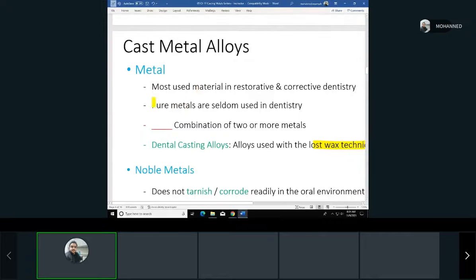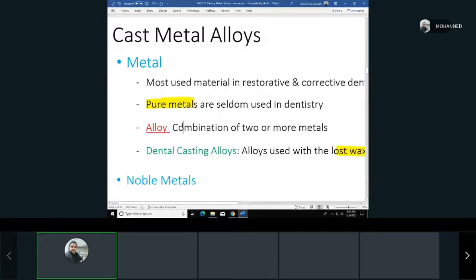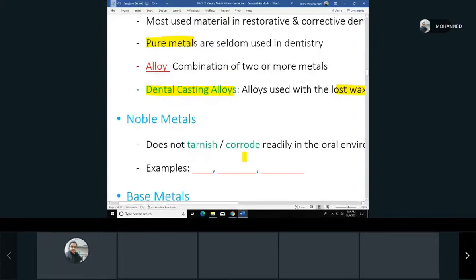We don't use metals right away as pure. We always use them as an alloy, right? Which is a combination of two or more, because this would provide us with better qualities of the metals that will make them withstand the oral environment. So the metals that we use with the lost wax technique, we call them dental casting alloys, because we cast the material with them. So just some terms to understand.